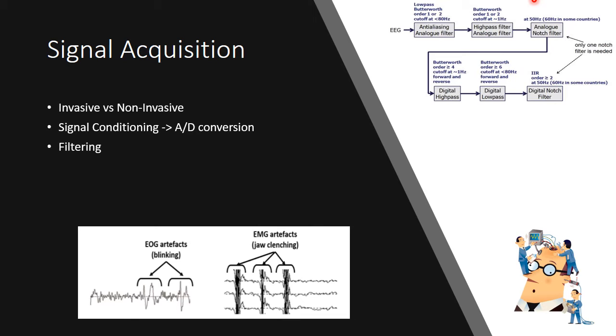digital conversion. Unwanted noise can be the biological signals like EMG, ECG, and skin effects, and it can be the electromagnetic noise like power line noise, or it can be due to the eye blinks and electrode malfunctioning. Some of these noises can be removed by applying the filters, like power line noise can be removed by applying the notch filter at about 50 hertz or 60 hertz, and eye blinks, which appear to be the low frequency signals in EEG, can be removed by applying a high pass filter with a cutoff of 1 Hz.